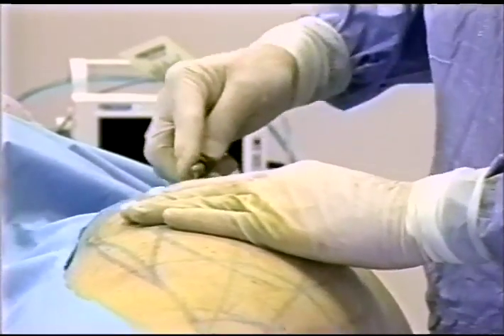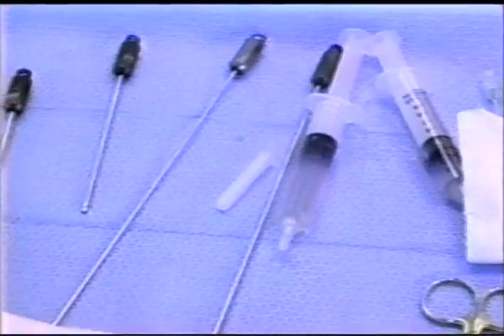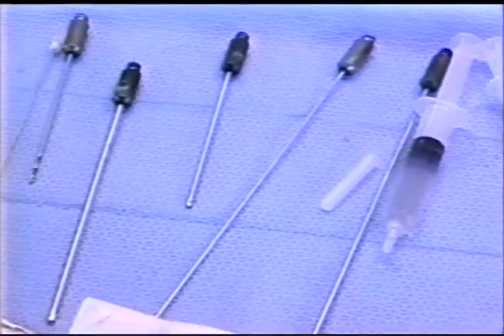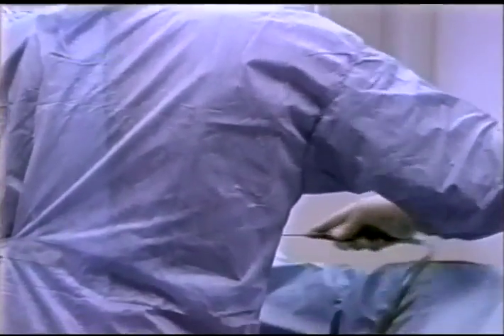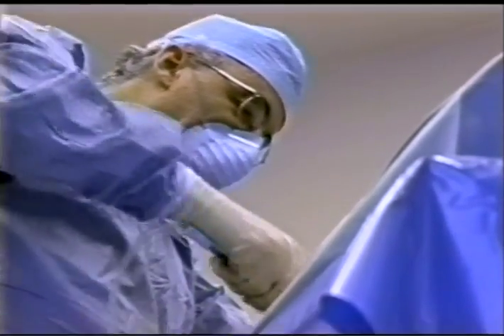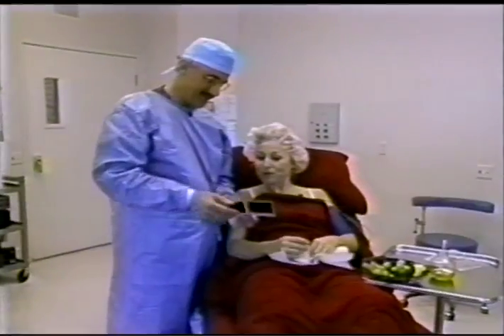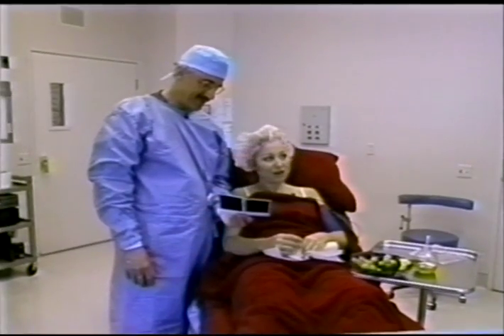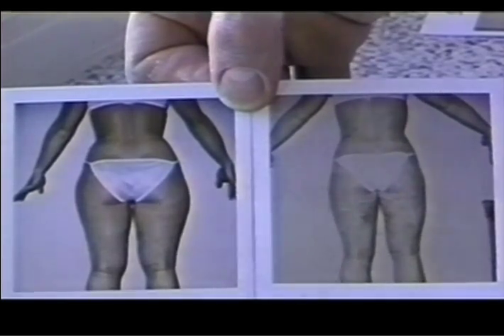And that's about it. The new liposuction technique allows surgeons to work closer to the surface of the skin. And the new instruments are tiny, some no more than 1/8 of an inch. The best surgeons possess both technical skill and artistic finesse. You're doing something under the skin, and you feel around very carefully to make sure that there are no areas of lumpiness or bumpiness. It should feel smooth everywhere. Wow. At the end of her 5-hour surgery, Christy Turley saw the difference immediately, and she was overwhelmed.